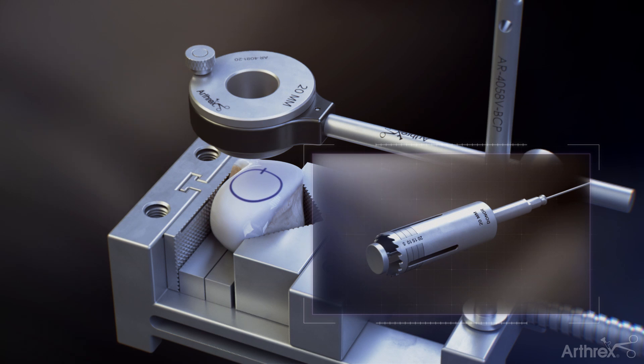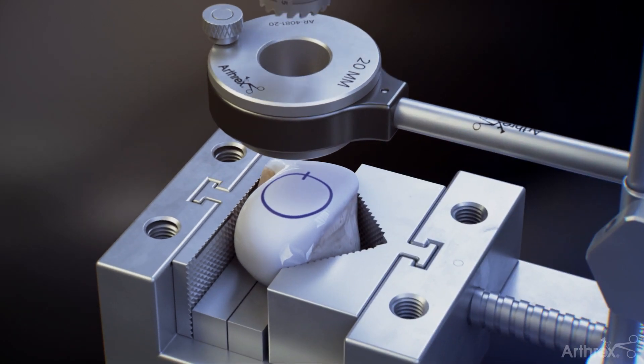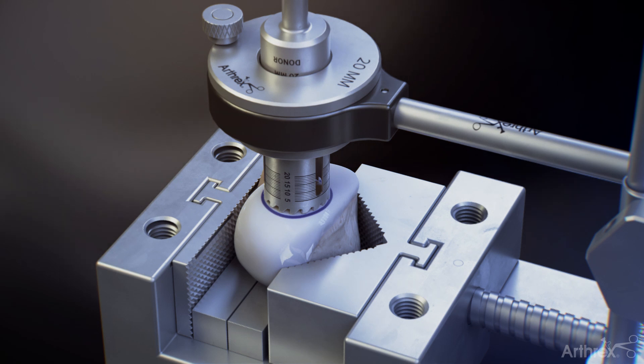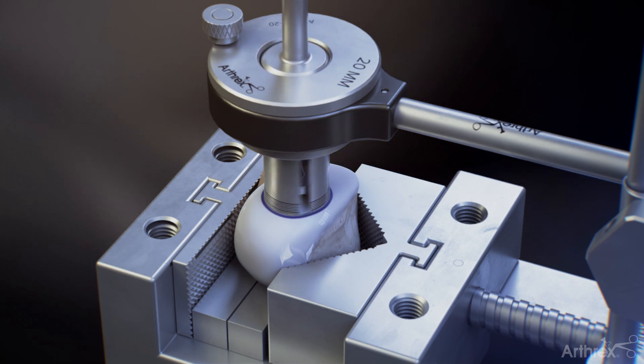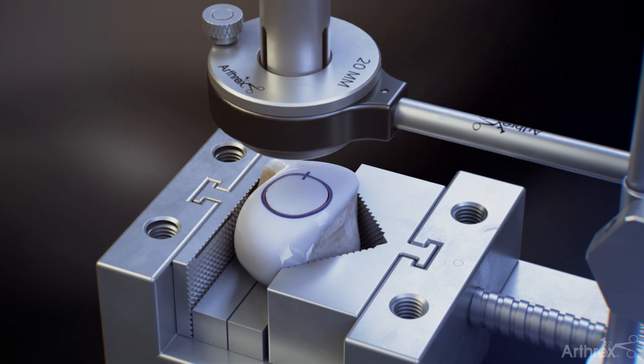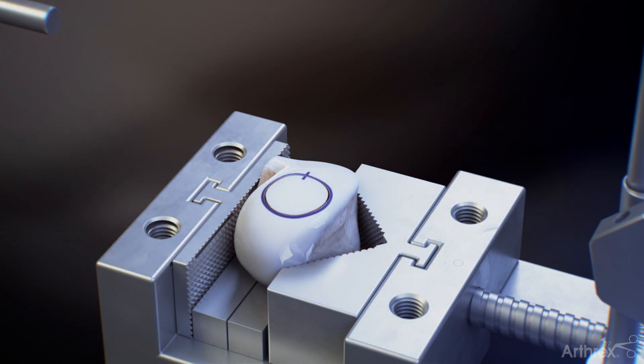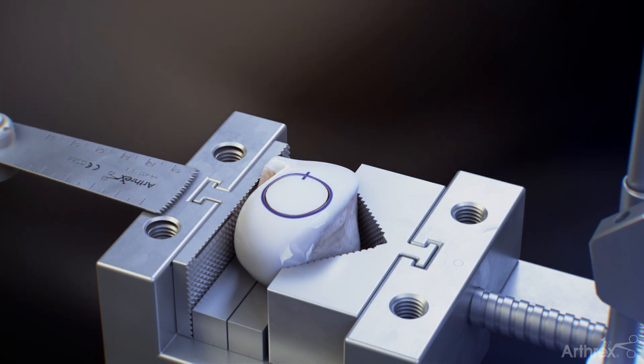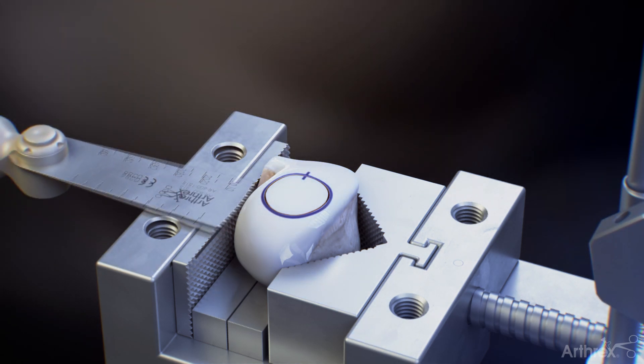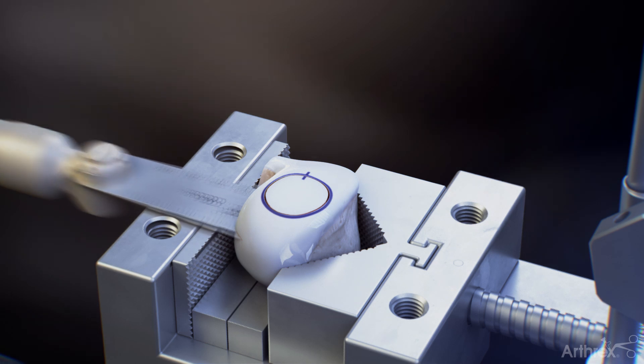Connect the allograft OATS donor harvester with a collared guide pin to a drill and pass it into the proximal graft housing to rest on the graft's surface. Drill the harvester to a depth of 15 mm to 20 mm and then remove it. Advance a sagittal saw perpendicularly through the condyle at the approximate depth of the reaming and continue until the core releases.